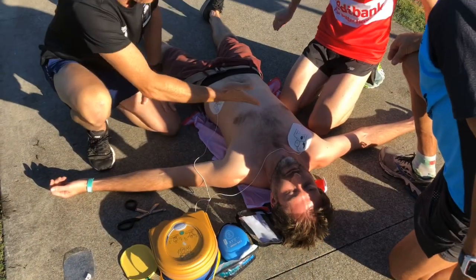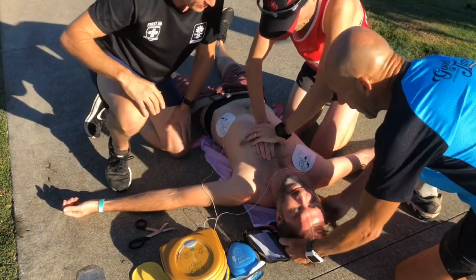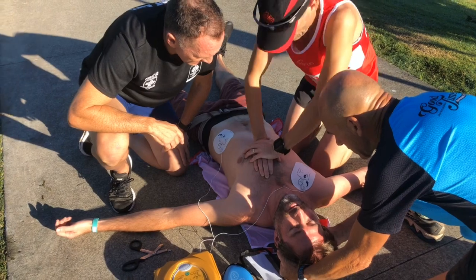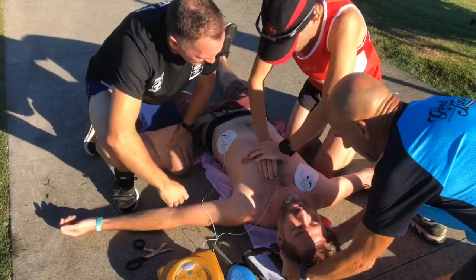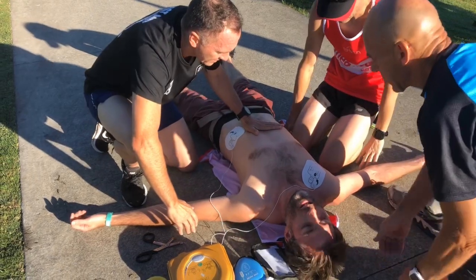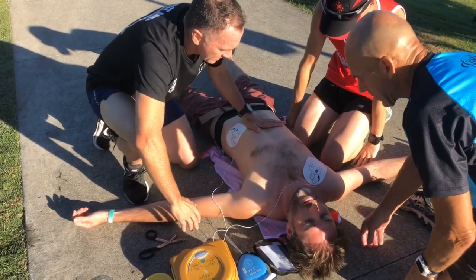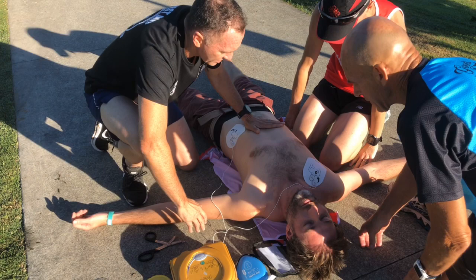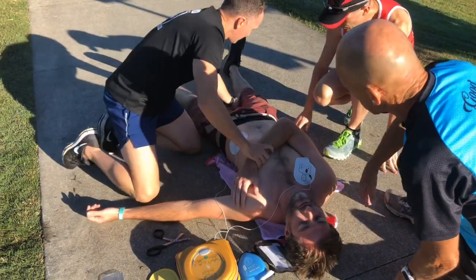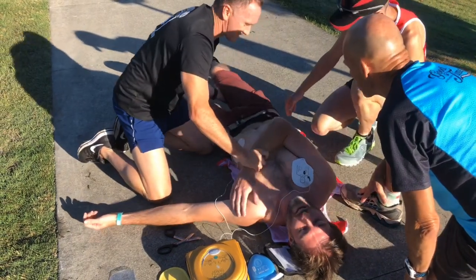Place overlapping hands in the middle of the chest and press directly down in time with the metronome. Continue CPR following the prompts of the defibrillator. If the patient starts to breathe, stop CPR and place the patient into the recovery position. Monitor until the ambulance service arrives.